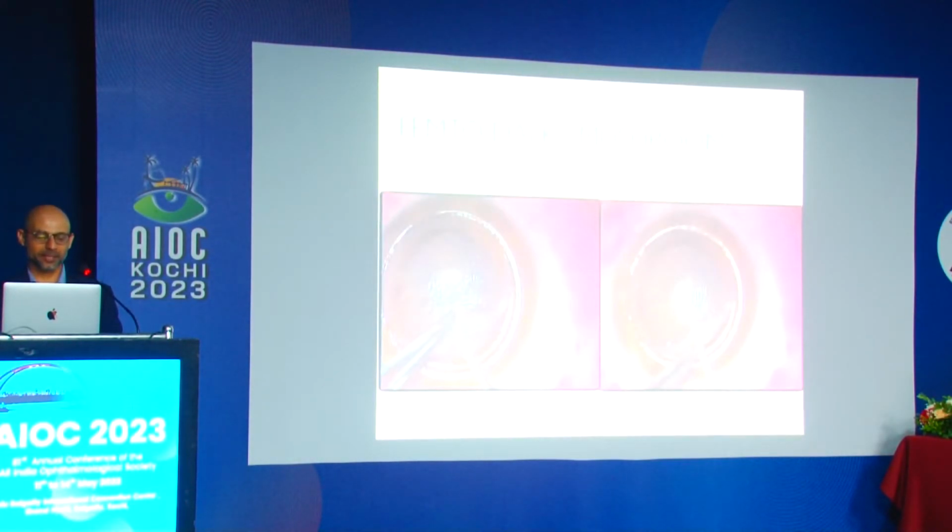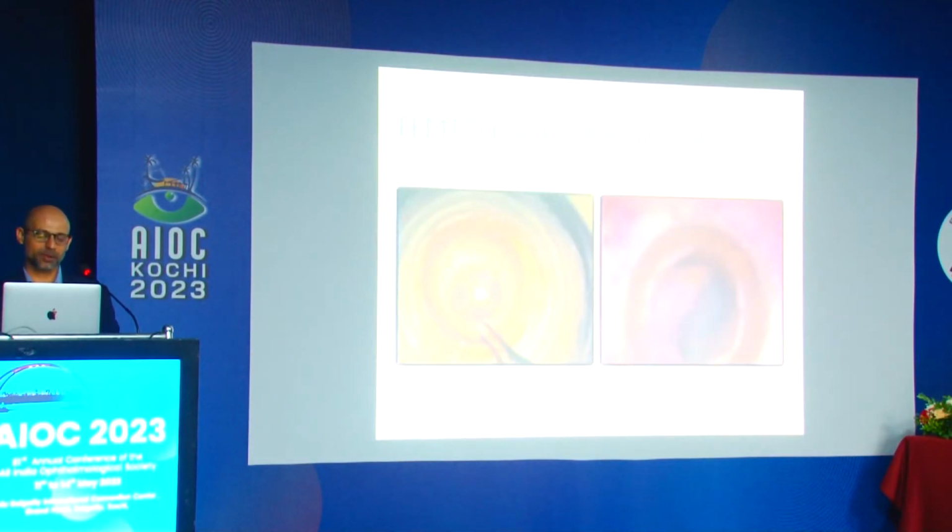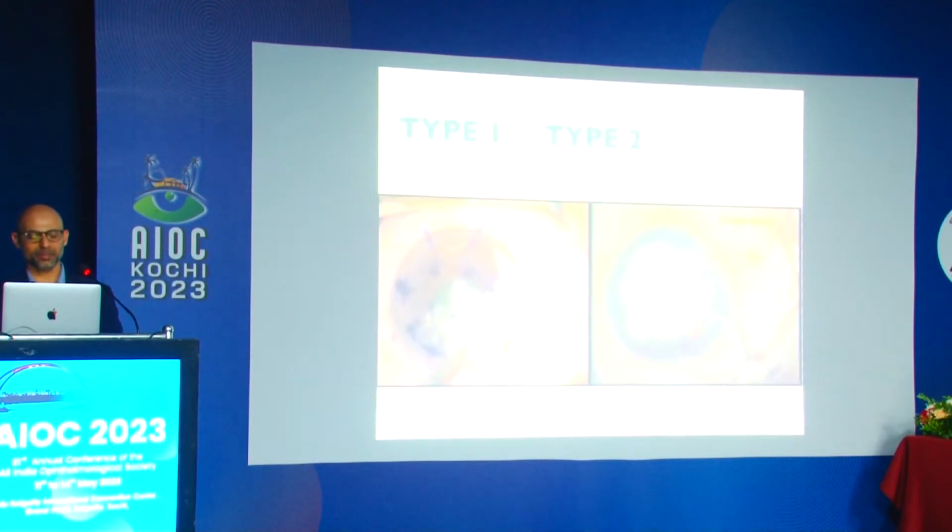Femtosecond lasers, like I said, give you shaped cuts like these, and they help you reach the desired plane. And essentially, once you've got the bubble, the rest of the surgery is quite similar. And like I said, because the donor is also shaped exactly, it fits very well and can be sutured nicely. So this is what a type 2 bubble looks like.